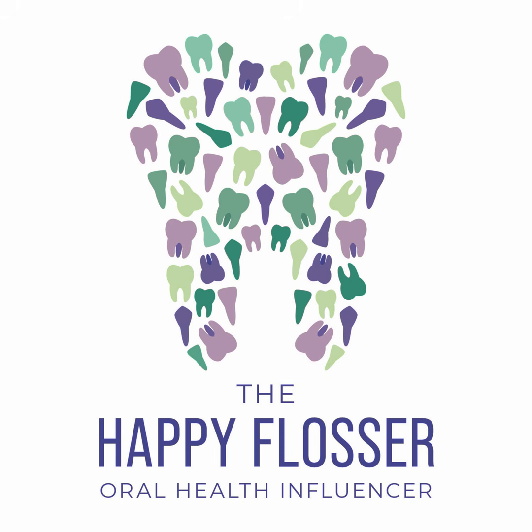There are so many different levels of density being displayed on that one image, especially when you have a patient who maybe has a ceramic crown and a gold crown. Those are going to show up differently because ceramic is a different density than gold. So I want you to just take a moment and pause. Look at your radiograph. Look at that image with a completely different perspective, only considering the density of the objects that you are trying to take an image of.